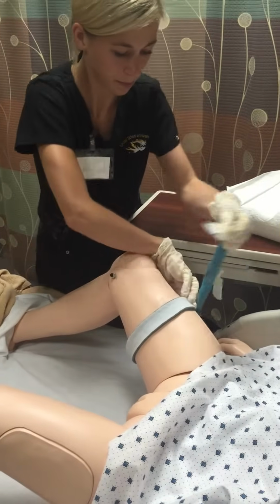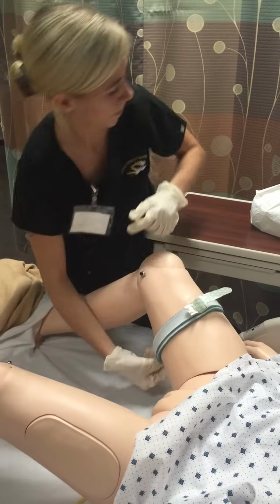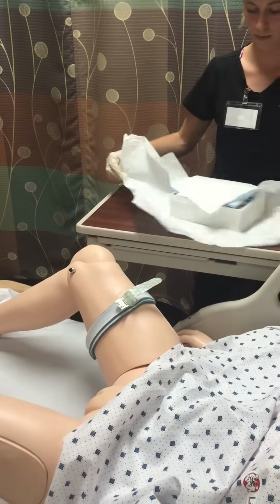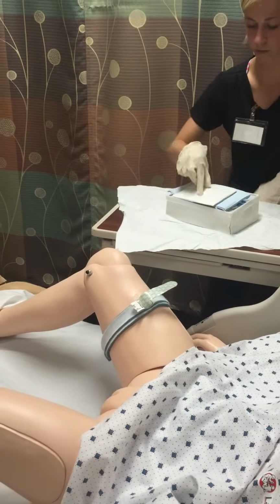We'll also have to drain your bladder for the surgery. It'll keep your bladder from rising, maybe getting in the way, possibly getting nicked. So it's just for your safety. I'll let you down and get you into position. But this hand, like this hand, hold it.